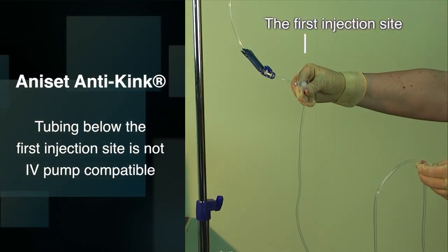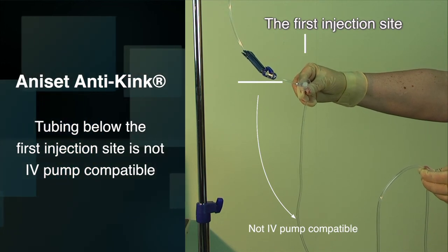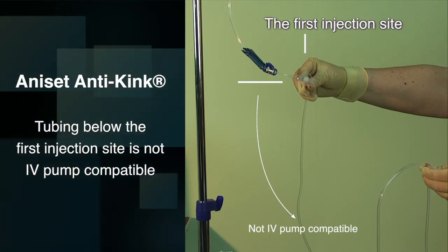Make sure you have placed the correct part of the anti-kink IV set into the IV pump to ensure correct working apparatus.